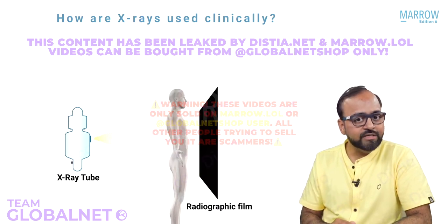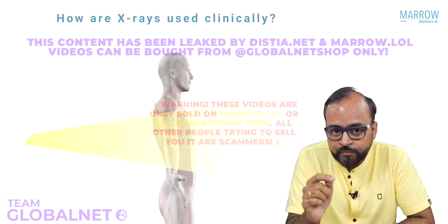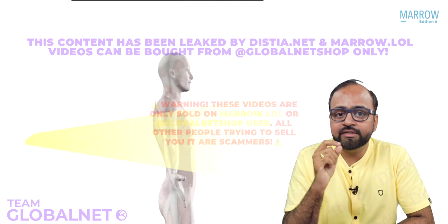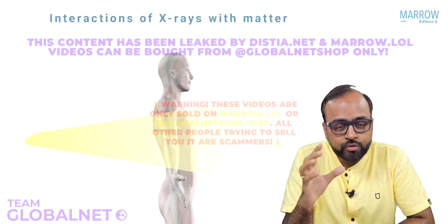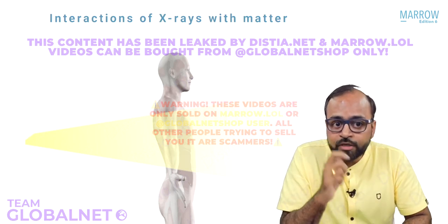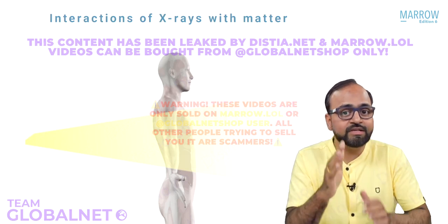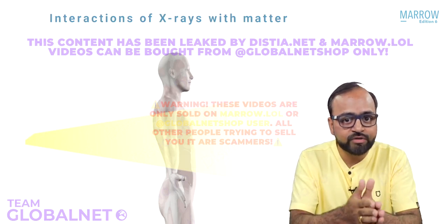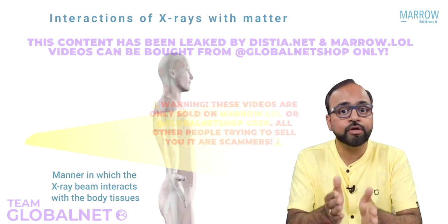Now there's something interesting which occurs inside the patient's body, and that is what is called interactions of X-rays with matter. Let me be absolutely clear. I'm going to repeat it again. Tell me, what is the meaning of interactions of X-rays with matter and where do they occur? These are the various ways in which the X-ray beam interacts with the patient's body tissues.